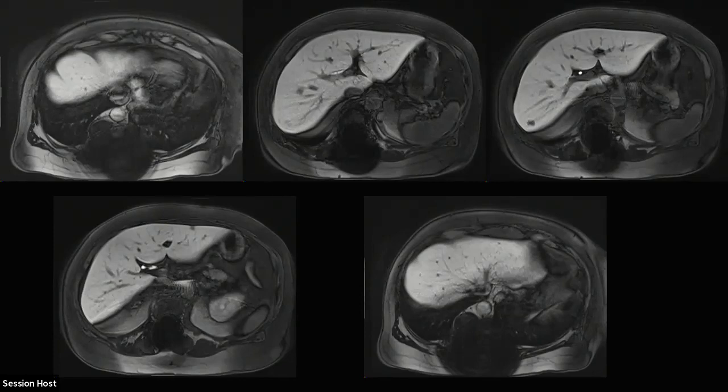Videos that we can look at the end. And obviously, in this case, this is basically a young person with multifocal liver mets from a colorectal cancer.